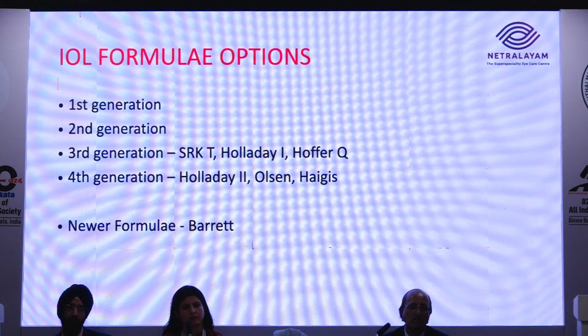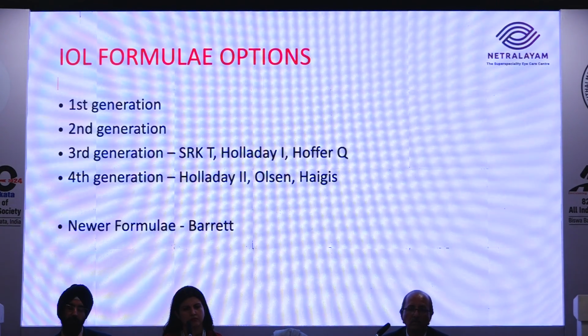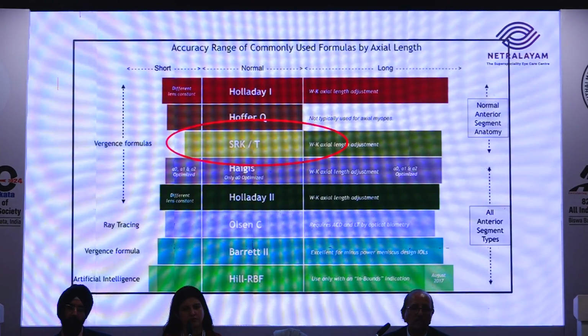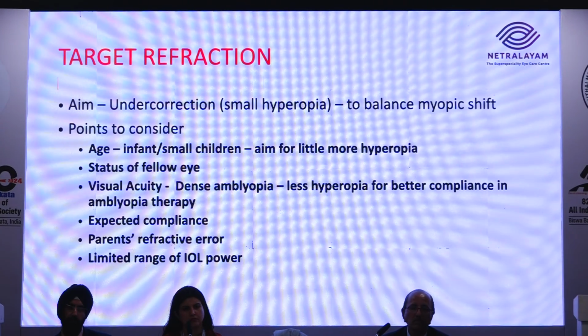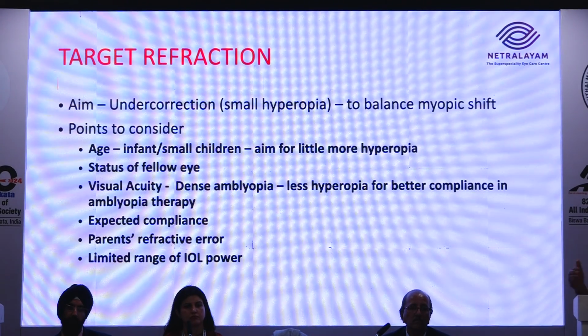Formula, I think most commonly what I use, I would say, is SRK/T, in smaller eyes Hoffer Q, and we can use also the newer Barrett formula. And this is another important factor, target refraction. If we aim for small hyperopia, then to balance the myopic shift, that is what we discussed just now.